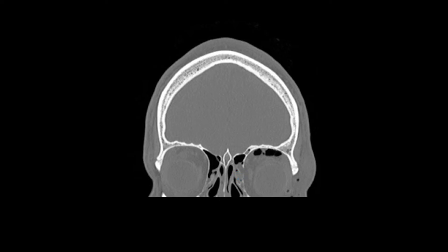The anatomy of the bony orbit can be reproduced on CT from what I have just shown you on plain film, and remains entirely true. You can see here the frontal bone contributing towards the orbital roof. Here is the frontozygomatic suture, and the bone contributing inferiorly would be the left zygomatic bone. Here is the medial wall of the orbit contributed by the ethmoid bone. You can see a similar appearance on the opposite side.